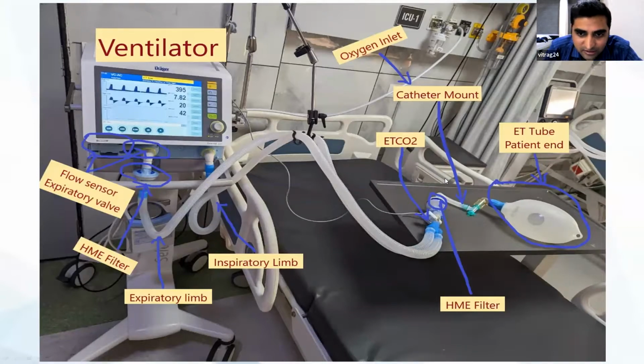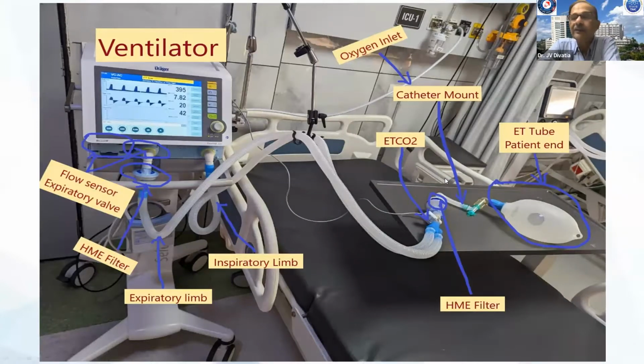So next question is, best ventilator for ICU. You answer, sir. One that fits your budget, one that has the company that gives you good service and good backup, and which sort of the staff in your ICU are comfortable with handling. I think that would be the bottom line.